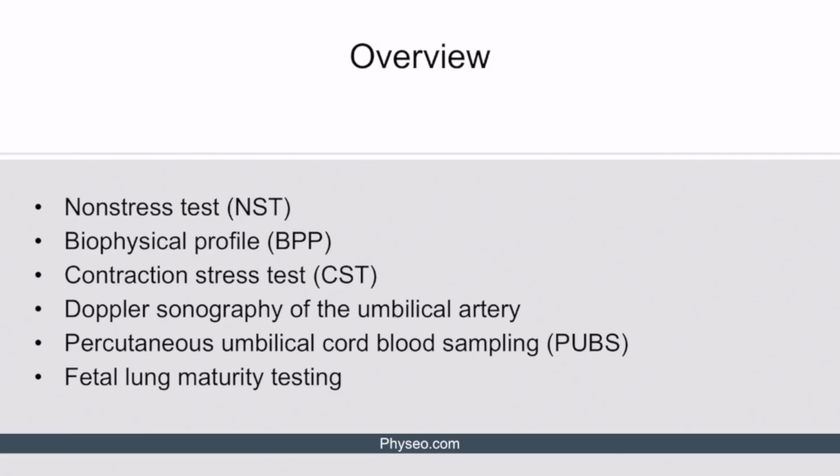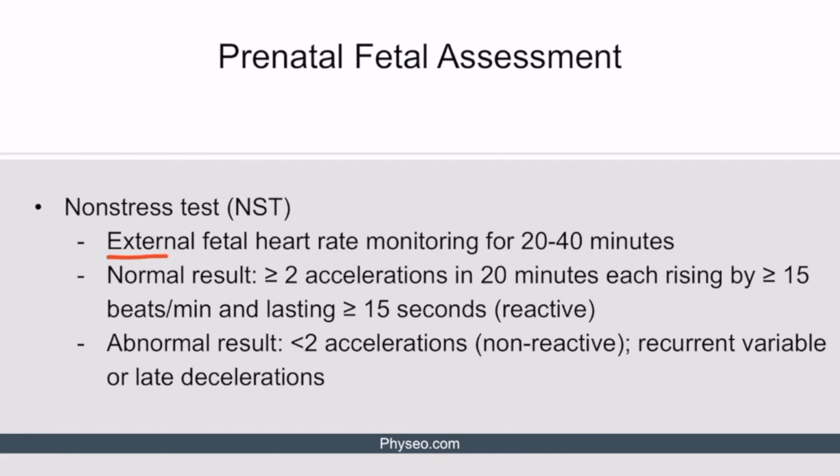Let's get started. Here's a list of the elements of the Prenatal Fetal Assessment. So let's start with the non-stress test. A non-stress test is an external fetal heart rate monitoring for 20 to 40 minutes.